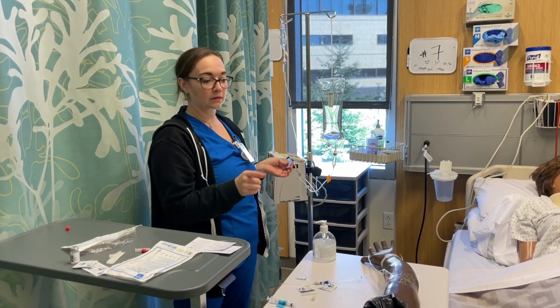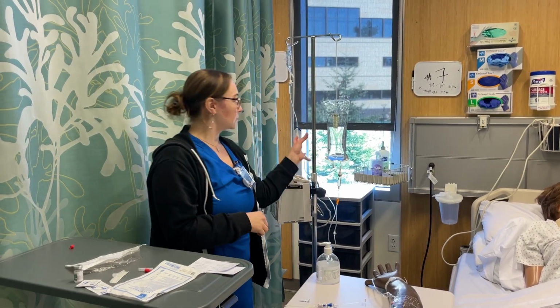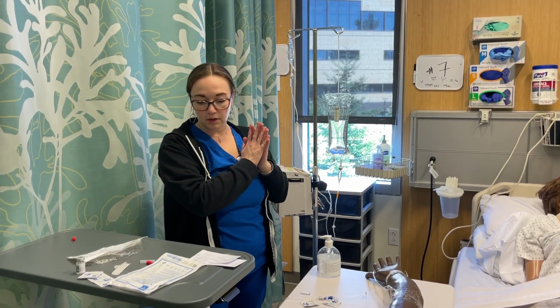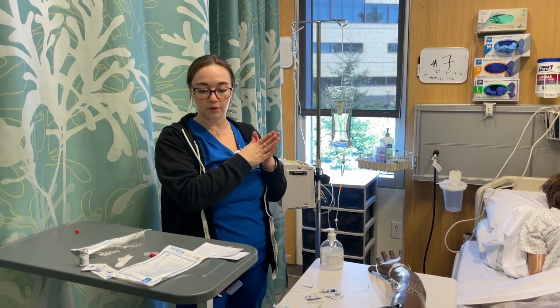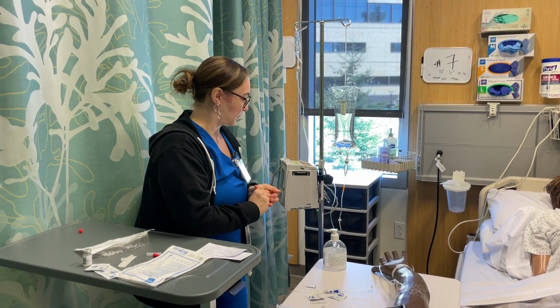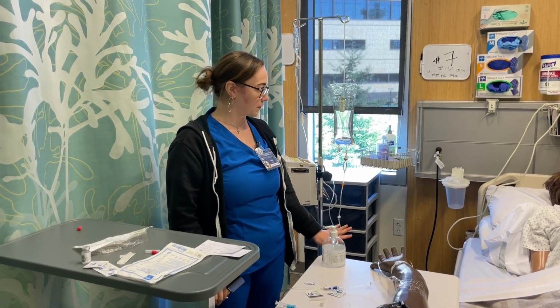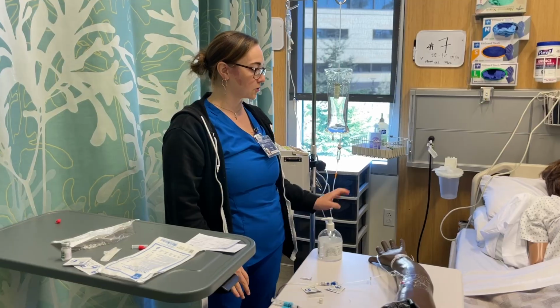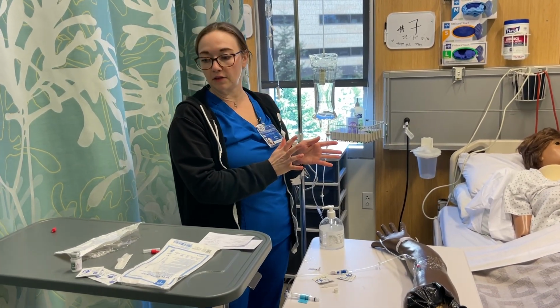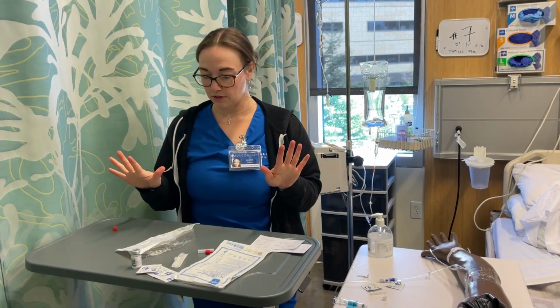I'd set a timer, and then I'd come back and check and make sure, and then set up the primary line back to the 5 drips per 15 seconds. And so I set a timer. I make sure that the patient has her call light, the bed is lowered. I'd ask her if she needed anything else, and I would go and chart.